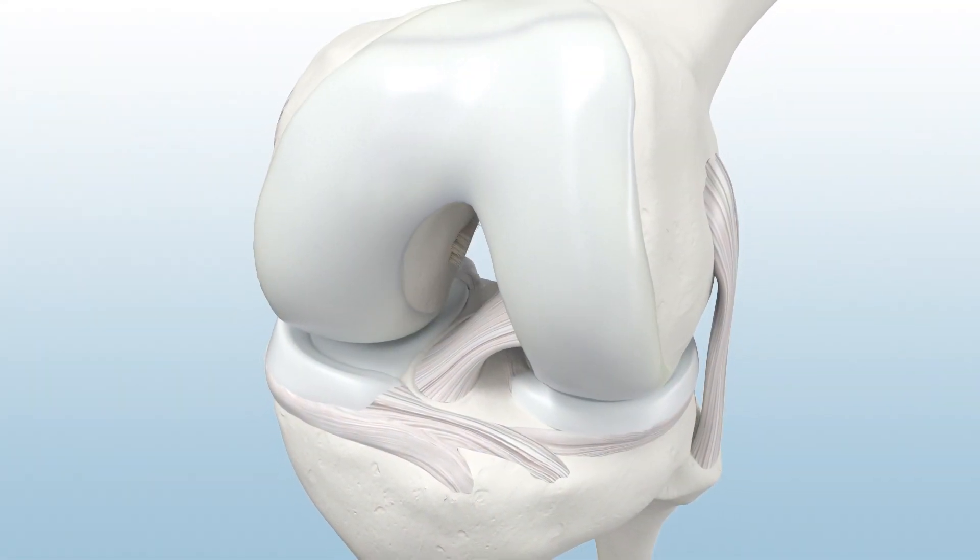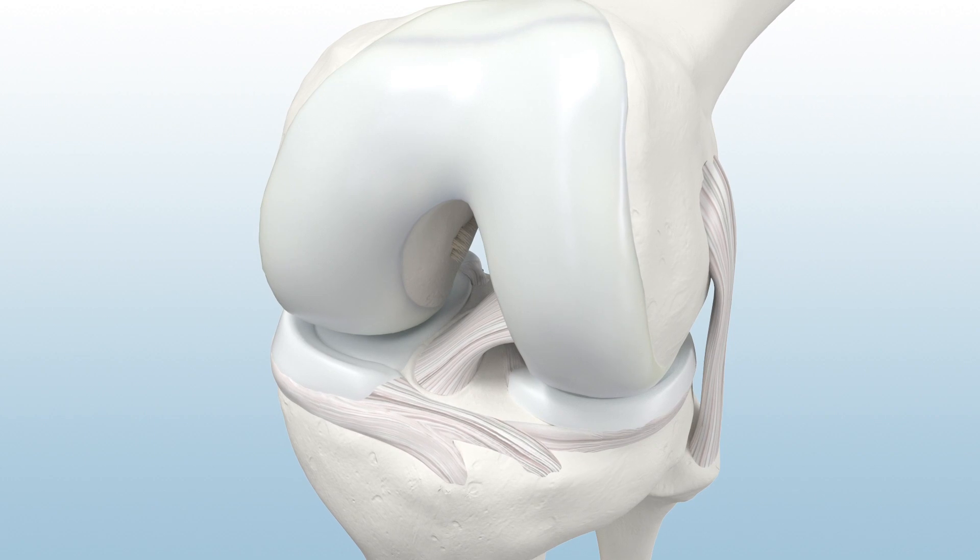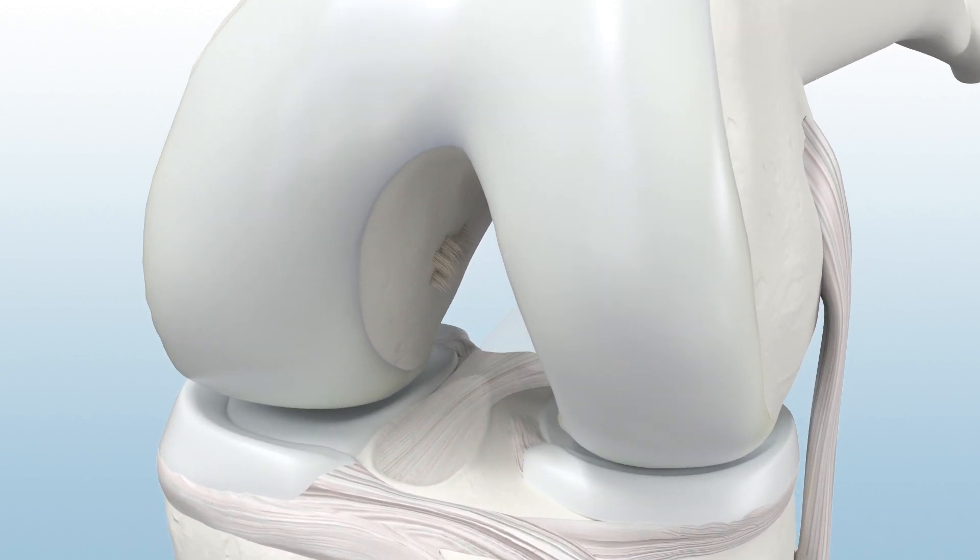To begin, locate the PCL's femoral anterolateral bundle attachment point, which can be located between the trochlear point and the medial condyle arch.